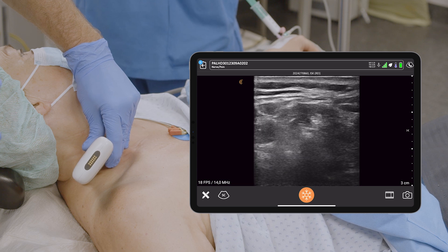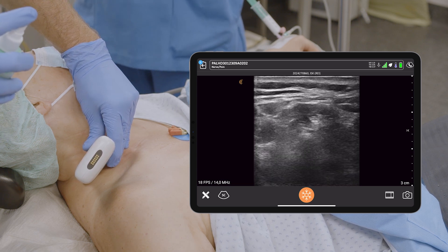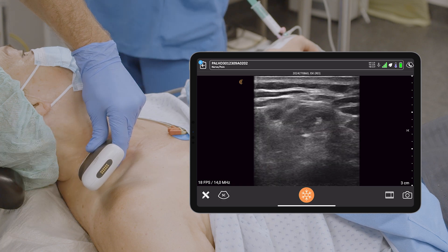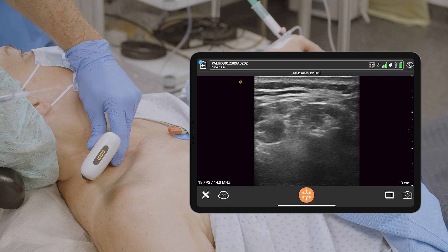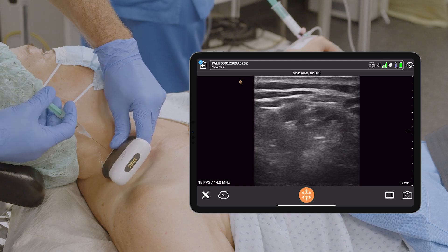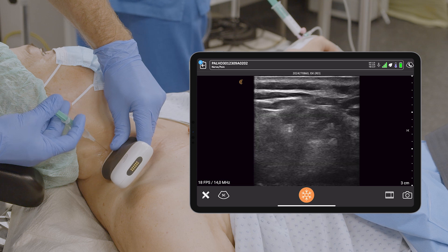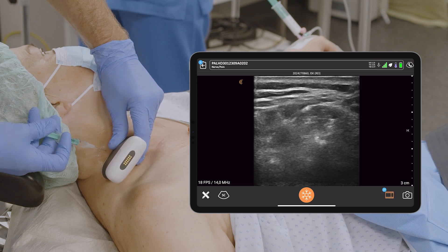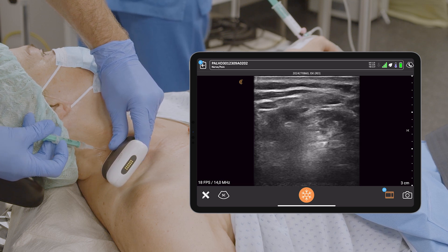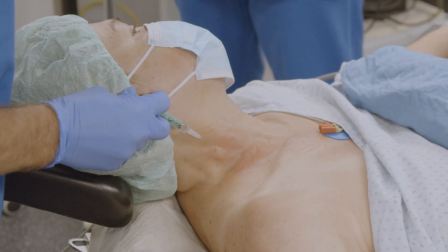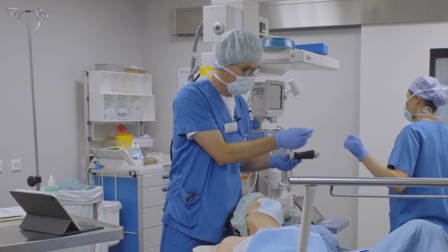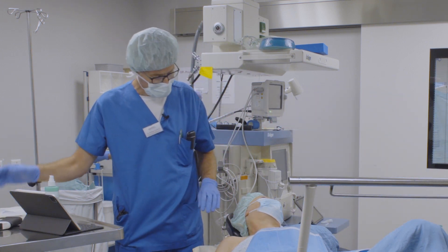The supraclavicular nerves are not seen very well here; however, even if they are not seen, we can still inject into the lateral cervical nerve pathway to numb these nerves. I keep my distance between the needle and the probe as it is not yet covered with a sterile cover. A little skin injection, then 'capture video' — I go in. The needle is dancing just a little to separate the horizontal fascia layers. I take the probe off and do subcutaneous tunneling with the local anesthetic in the direction where I will insert the catheter.